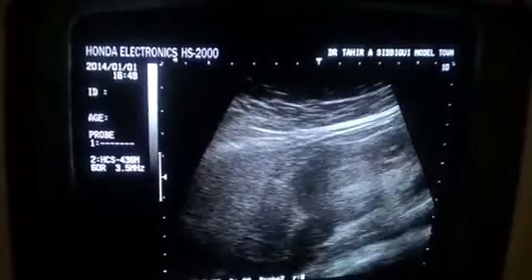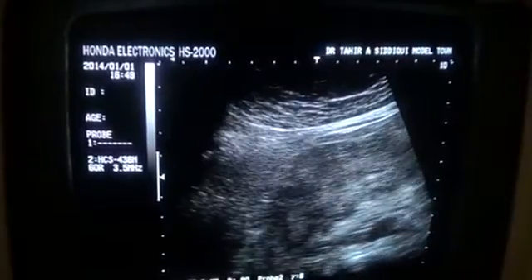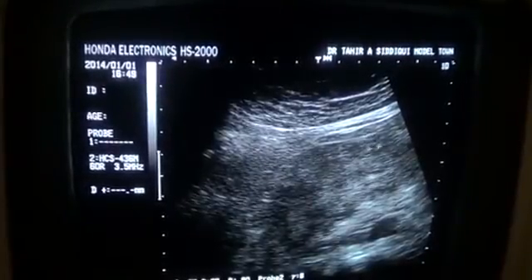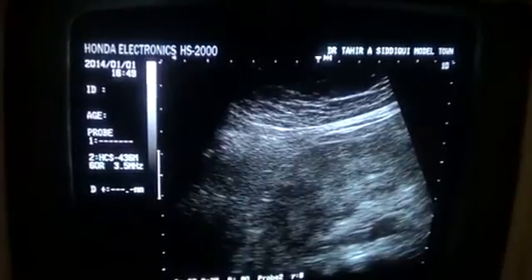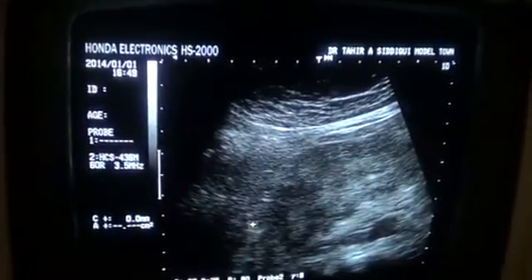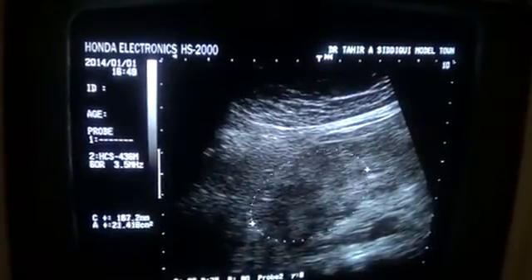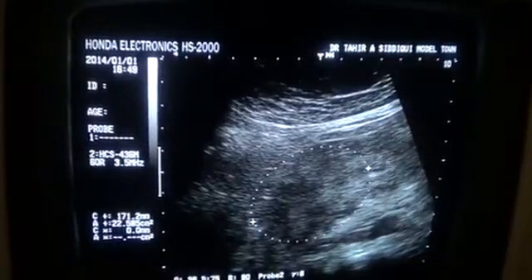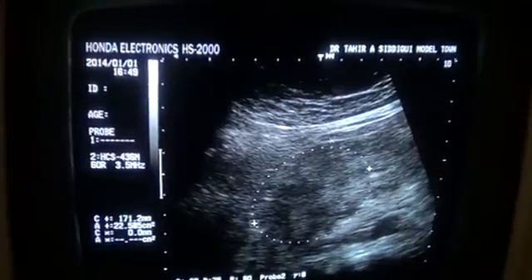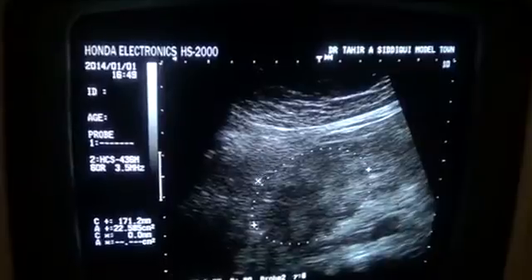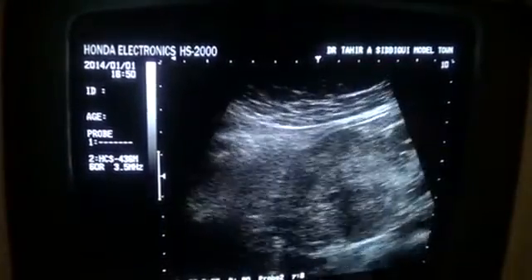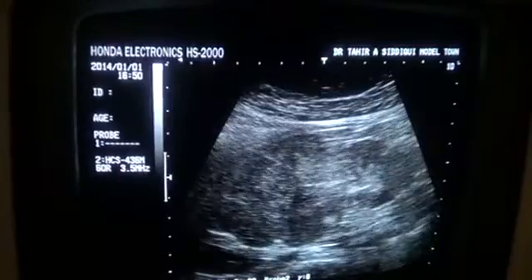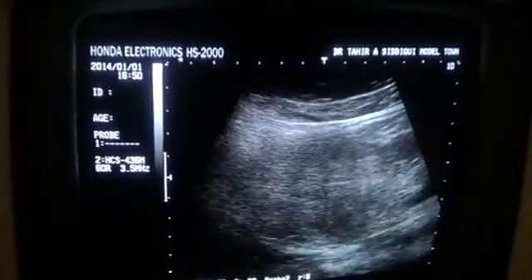Viewing from this angle, you will see that it is sharing the capsule of the kidney. This is the lower pole, this is the parenchyma, and this is the capsule — whereas this is the mass. This is the lower pole of the right kidney, and you can see the capsule is being elevated by the mass. So it does share and elevate the capsule of the kidney, and the perirenal fat is not visualized.